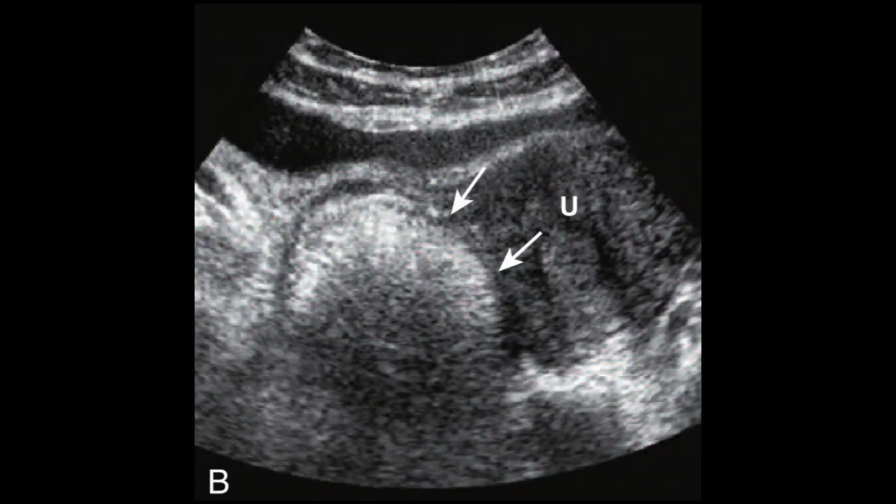So only the tip of the iceberg is visible. This sign is called the tip of iceberg sign, and this is the sign of dermoid cyst. So dermoid can be seen in this fashion, and this can be easily picked. Quite commonly you can appreciate dermoid in this form, and this will show the tip of iceberg.